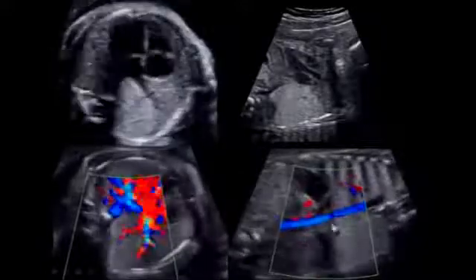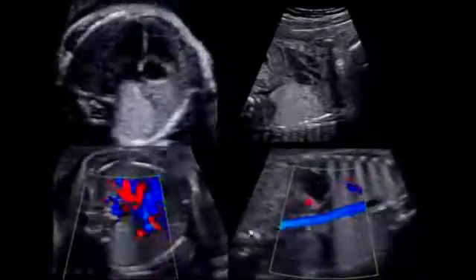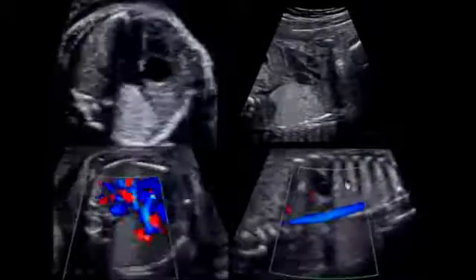This is a coronal image of the descending aorta, and we can confirm that the lesion, which is on the downside, it's on the right side here. Here's the stomach, so the upside's the left, and the downside is the right. Here's the lesion, and there's no systemic blood supply here. That's an entirely pulmonary blood supply. Again, a CPAM microcystic type.